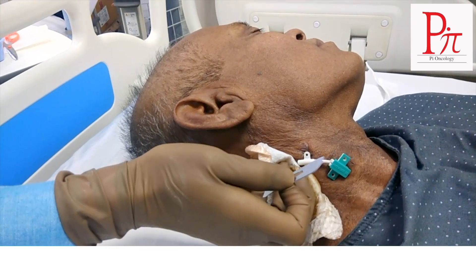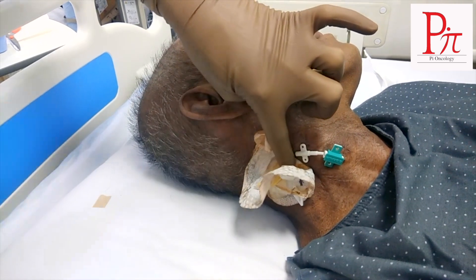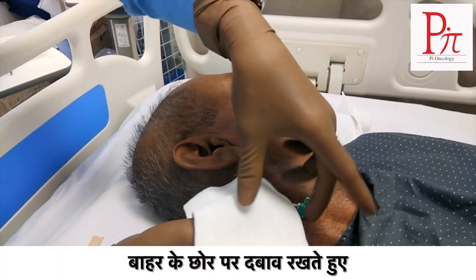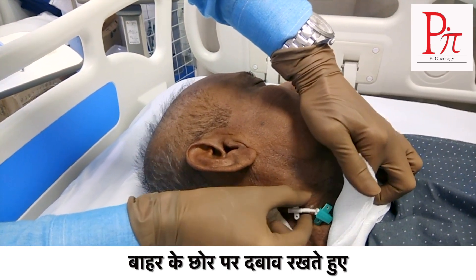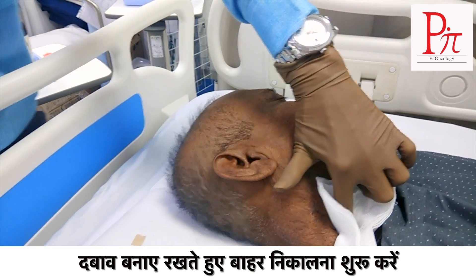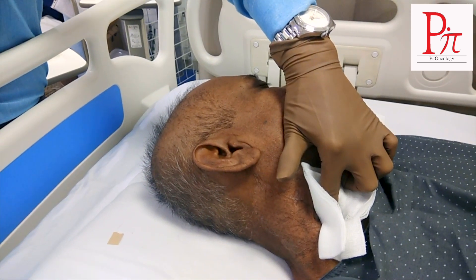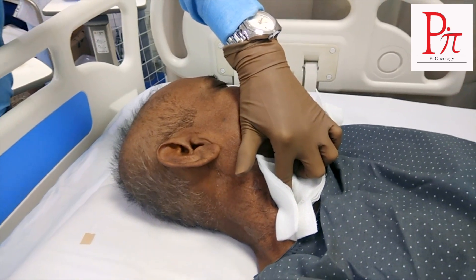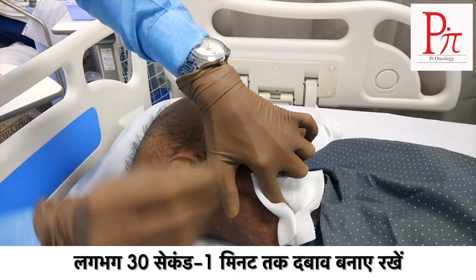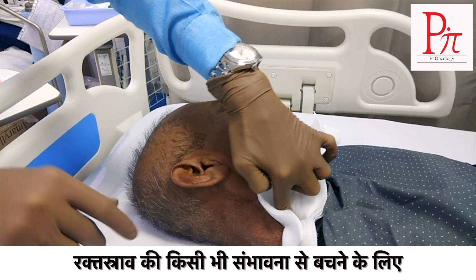Once all the sutures are cut, take a gauge piece. While keeping the pressure at the distal end, start pulling out while maintaining pressure. Hold the pressure for around 30 seconds to 1 minute so that there is no chance of bleeding.